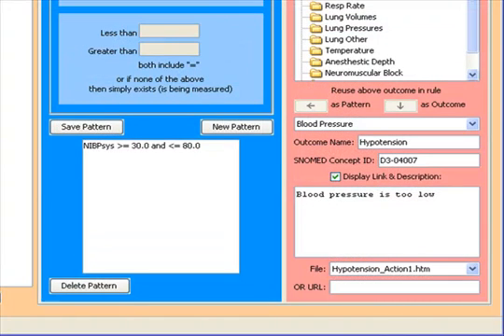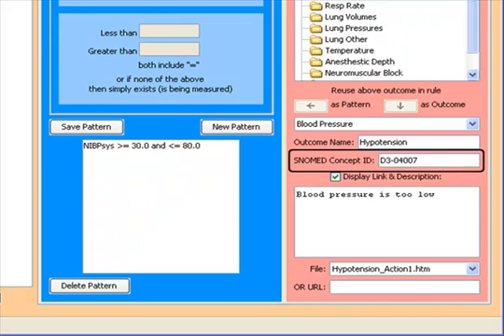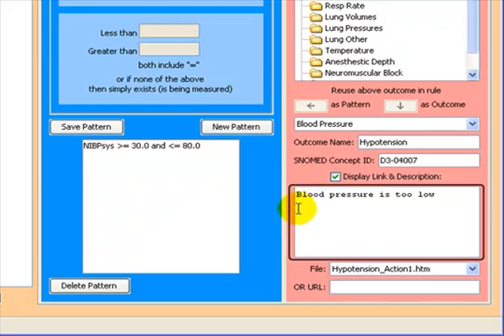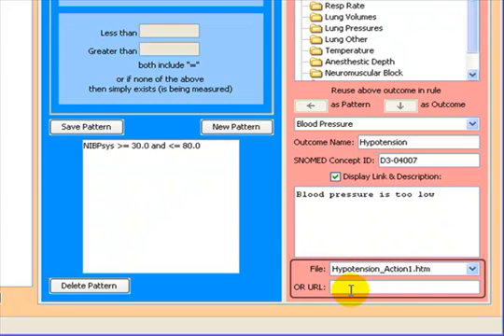We are able to give a SNOMED concept ID if appropriate. Once an outcome has fired, we are able to display further information about that particular outcome or link it to some local file or other URL that will provide just-in-time information associated with that particular rule.